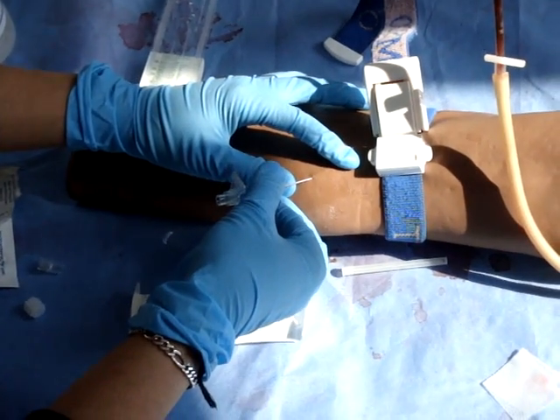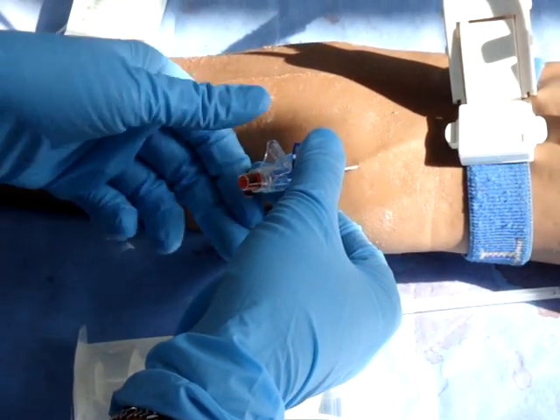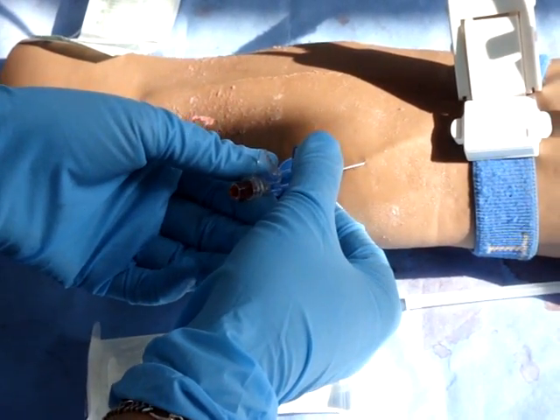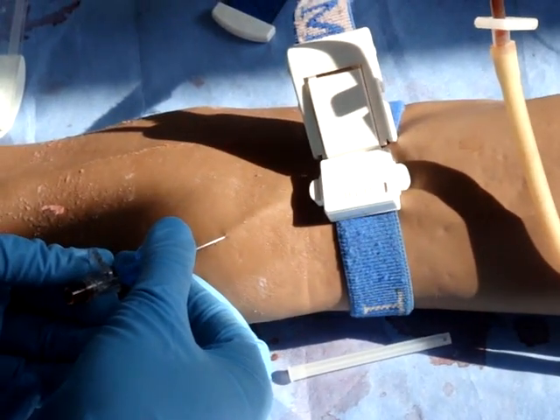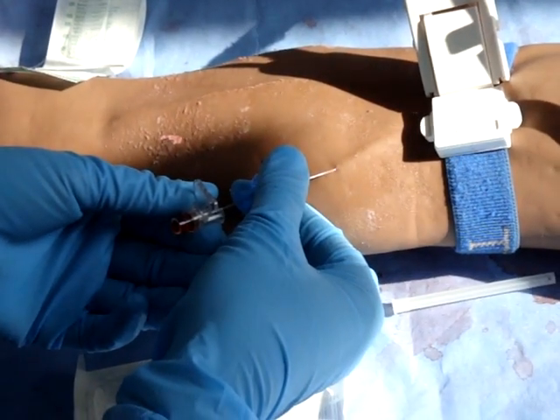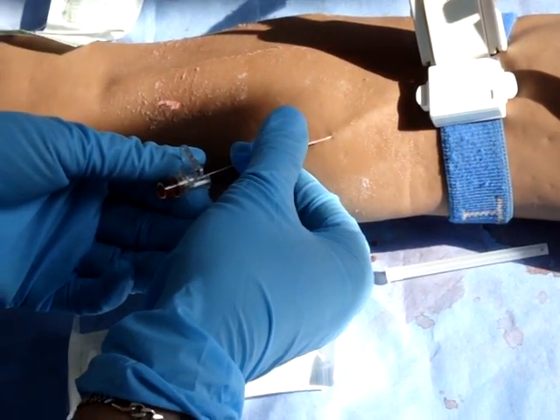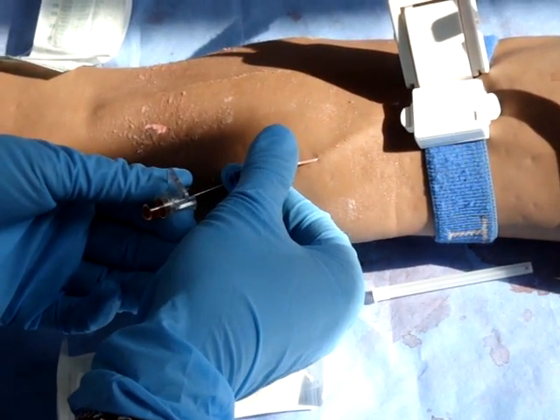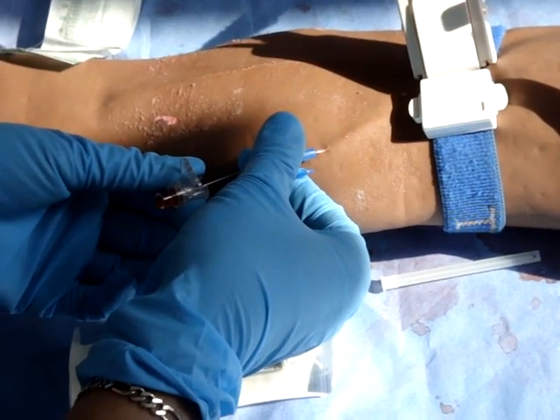Once you have reached a vein, you will get backflow of blood into the cannula. Then slowly and surely, push the cannula in while retracting out the clear plastic part. You're pushing it in and pulling it out, pushing in, pulling out, until the cannula is fully inserted.